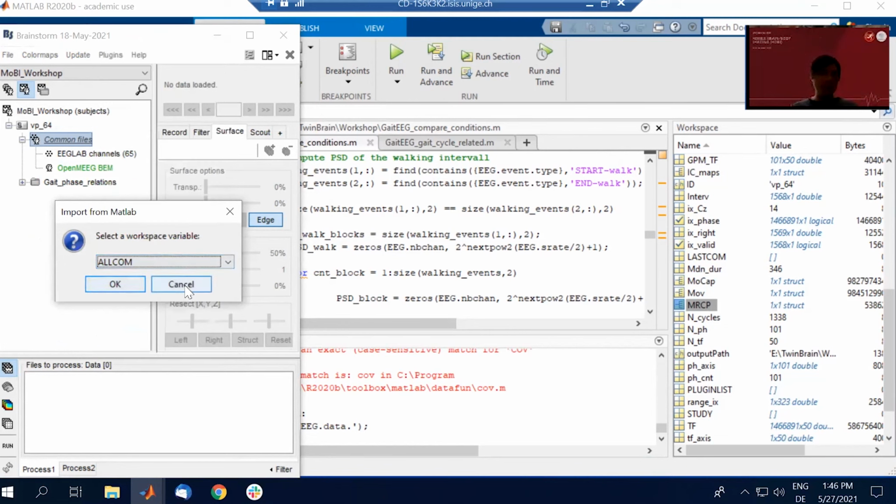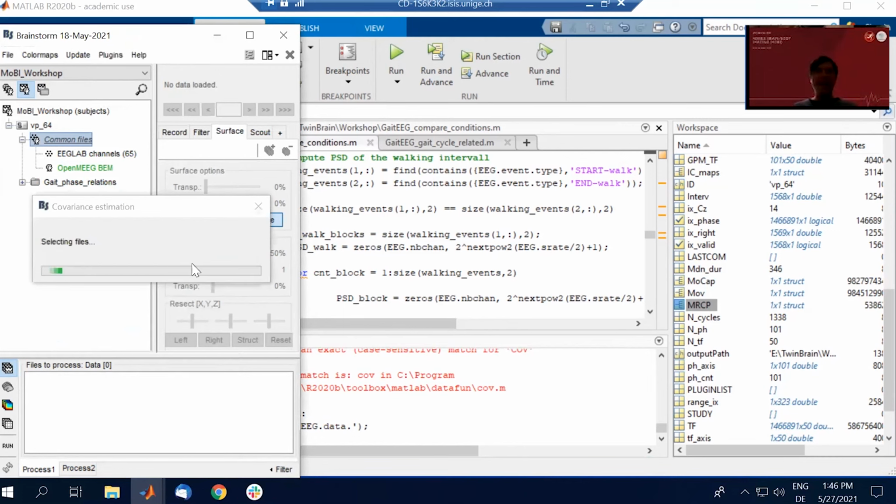But you should model your covariance matrix, which is somehow the noise condition. It comes a bit from MEG, where people usually use empty room noise measurements for computing these noise covariance matrices. In EEG, we have to define a baseline that doesn't contain any signal of interest. That is a bit hard in EEG, and that's why it makes it more difficult.